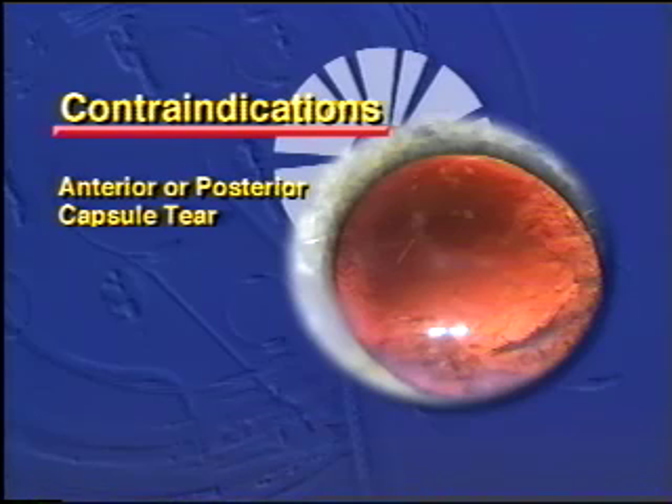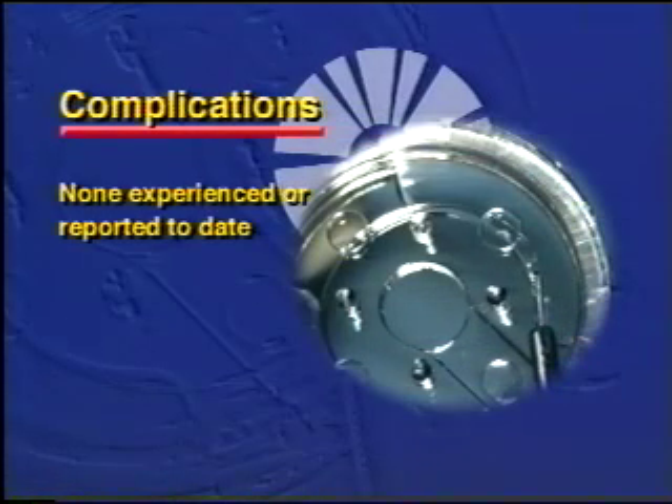Contraindications to the tension ring are anterior or posterior capsule tears. Complications have not been experienced or reported to date.